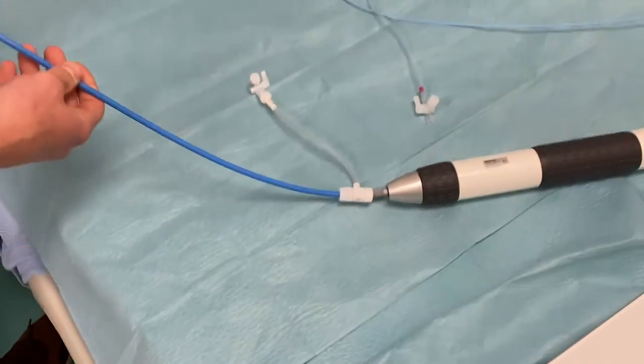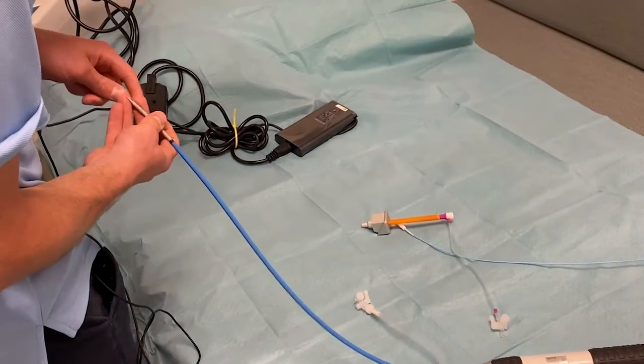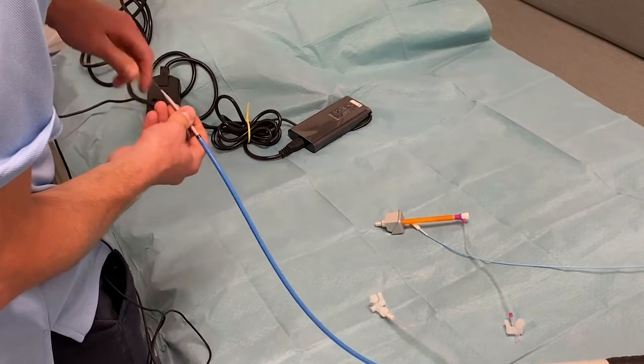This is the device here. We'll advance this up our wire.